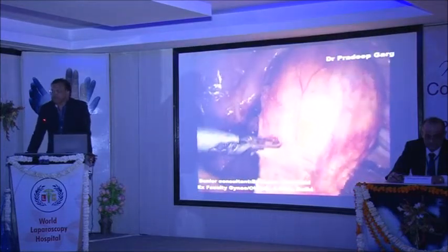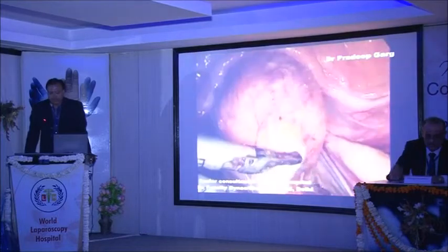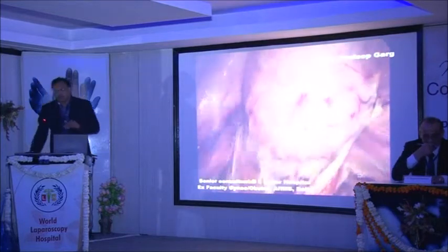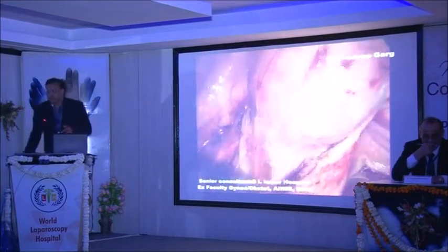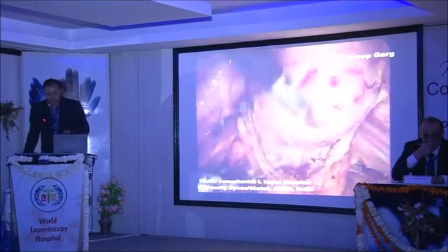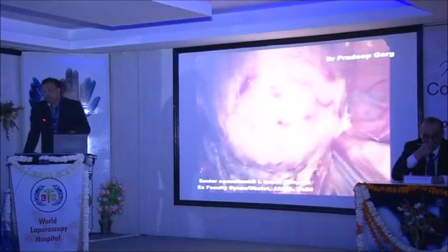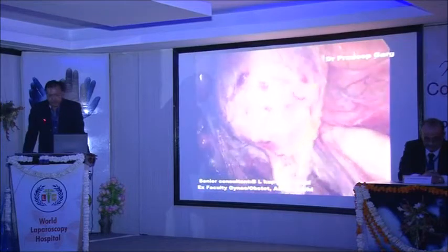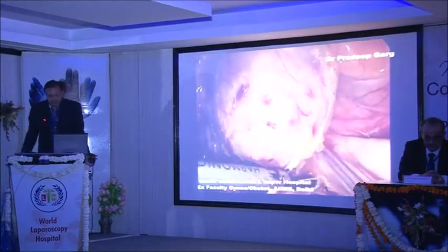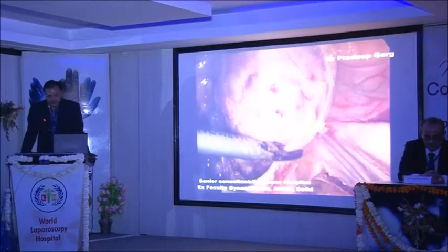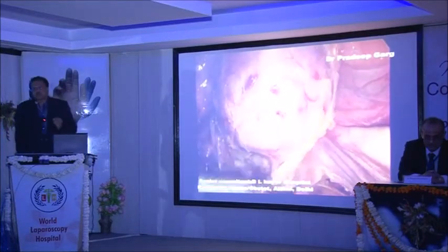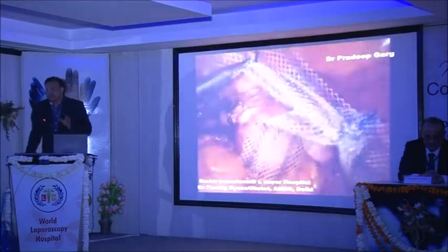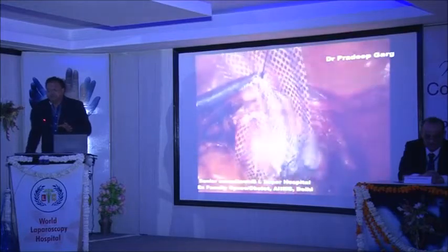Give a nick over the peritoneum and push the bladder down. Similarly, on the posterior aspect, you have to push the rectum down to expose the posterior vaginal wall, so that you can fix one arm of the mesh. Keep on dissecting till the levator ani. The rectum will fall down and you will be able to stitch the mesh over this. Always keep an eye on the ureter. After dissecting, do not use too much cautery over the sacral promontory area, because here you have to fix the mesh. Minimum use of cautery should be done.